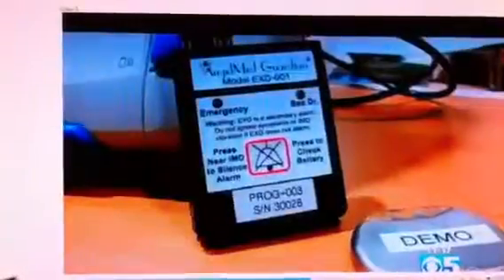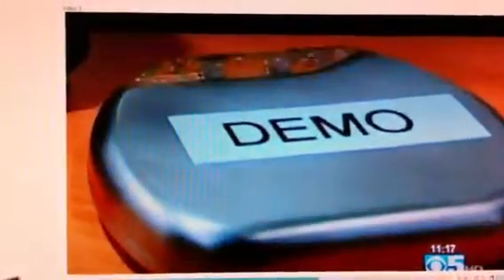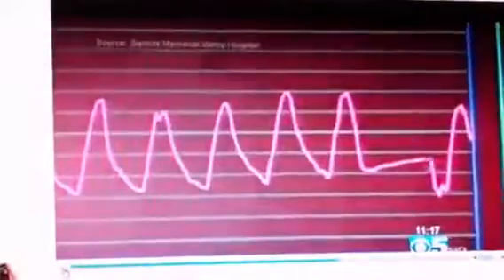Secondly, the patient has to carry a small black box that will beep if there's a problem. If it's an issue that does not need immediate attention, the device will tell you to call the doctor within a day and flash yellow. If it is an emergency, the box flashes red and the patient should call 911 immediately. This is absolutely a new concept in medicine, in the field of cardiology, where we'll be getting these patients way ahead of time, even before the patients know something really bad is happening to them.